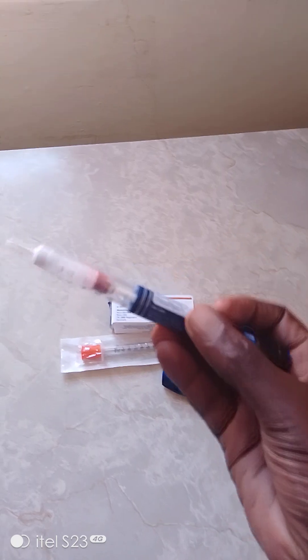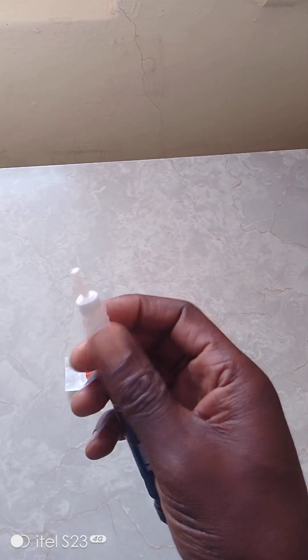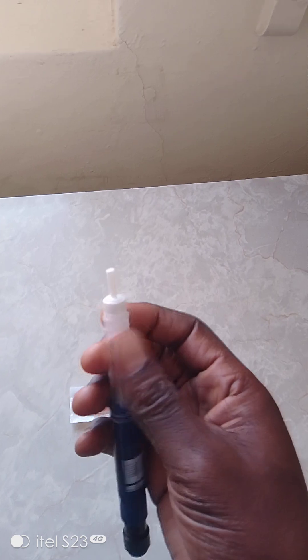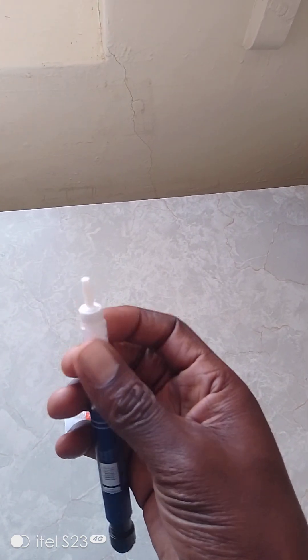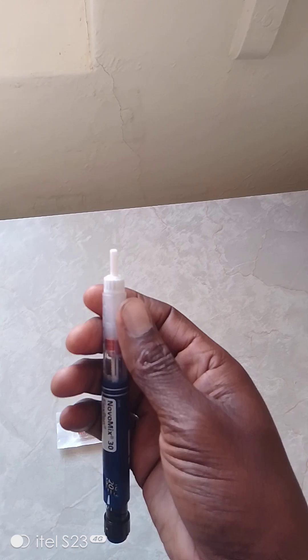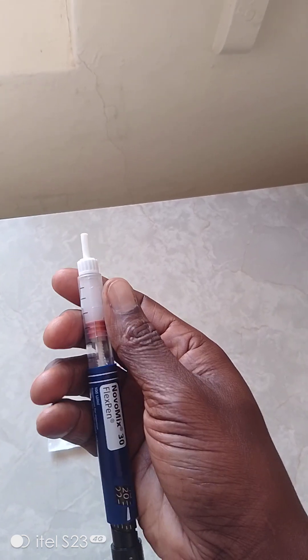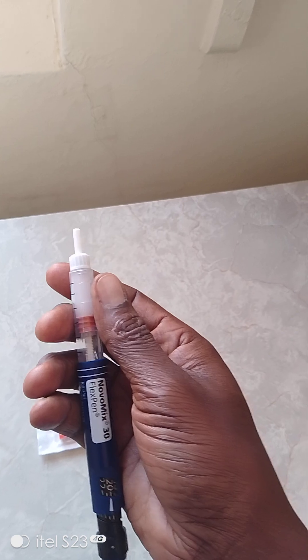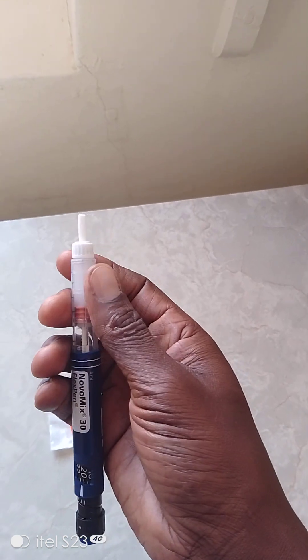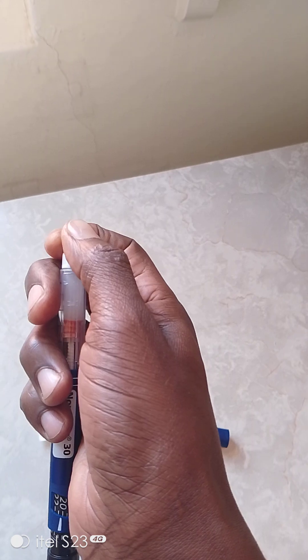People wonder since the insulin is inside - you can easily roll it like this to mix it. Don't shake, just roll it like this to mix the insulin nicely. This comes as a mix - it will have both long-acting and short-acting insulin. That's the advantage with this insulin here.